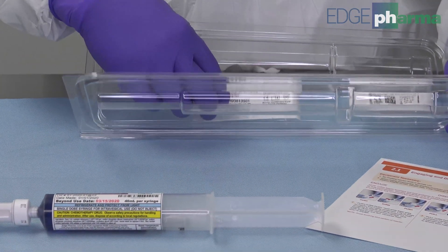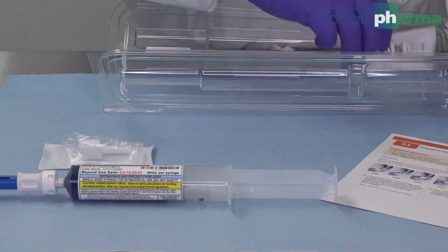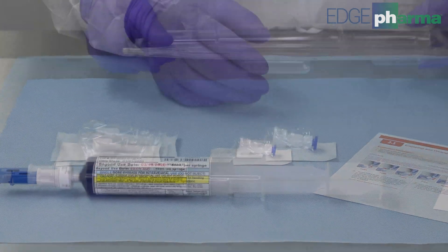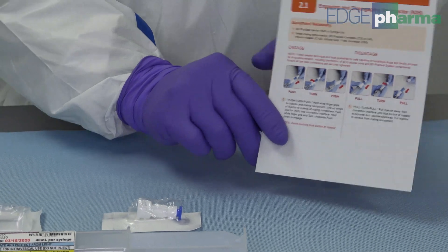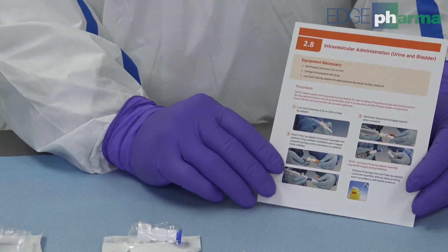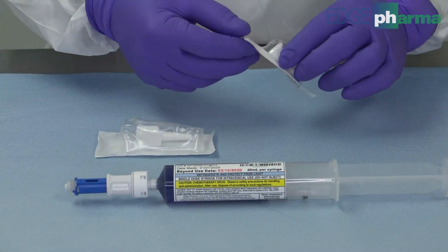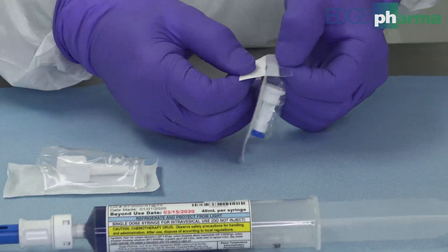Open the Mitomycin Kit and remove the contents. Please read the included instruction pamphlet. Affix the luer lock adapter to the catheter tip.